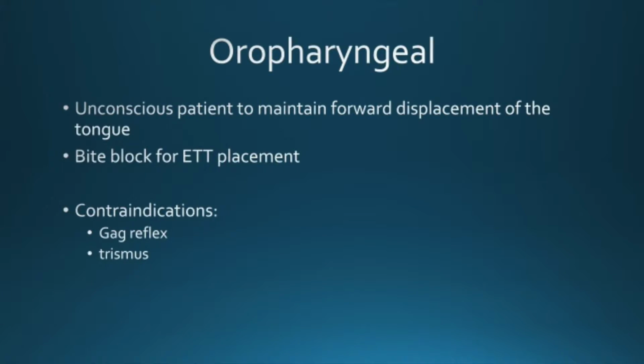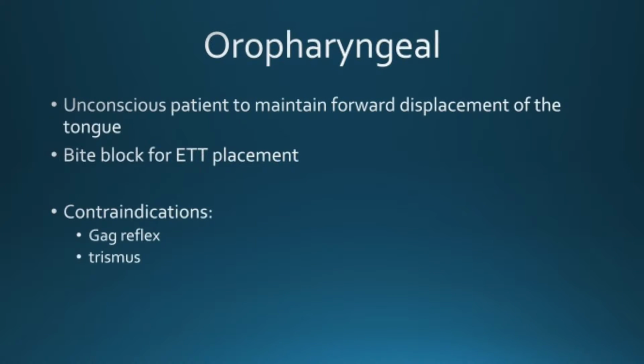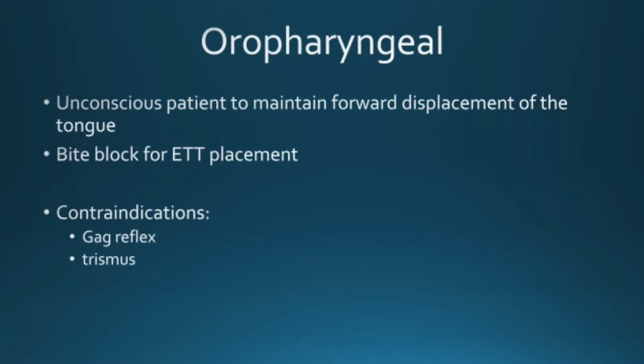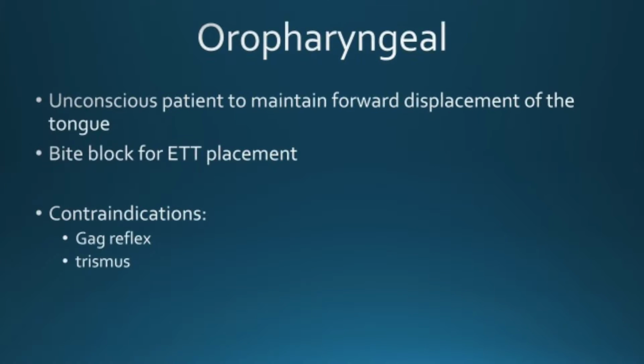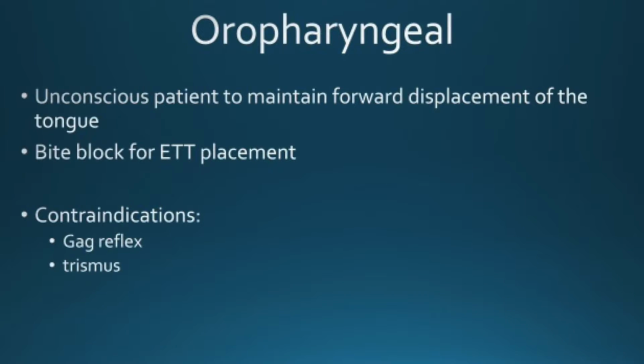The oropharyngeal airway is indicated in the unconscious patient to maintain forward displacement of the tongue, and also as a bite block for intubation placement. Contraindications include the gag reflex and patients with trismus.